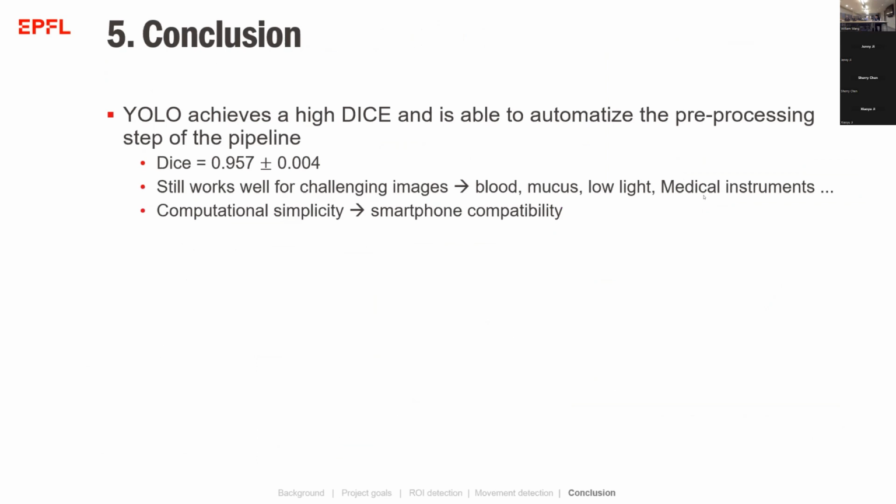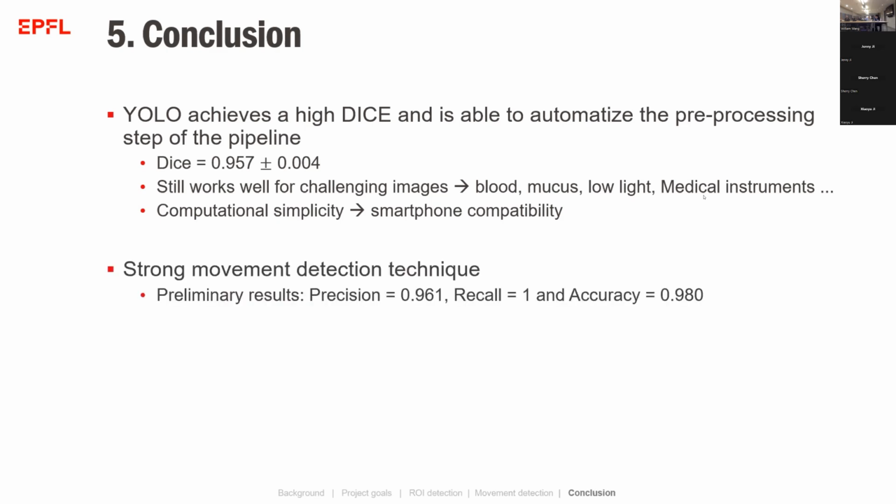So as a conclusion, with YOLO, we were able to detect the region of interest automatically, achieving pretty good results, and also detecting the cervix even in challenging images. Regarding the movement detection part, we also achieved high results, but we tested our method in a small data set.